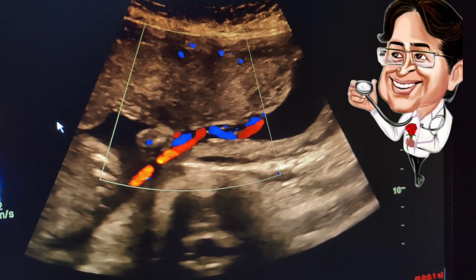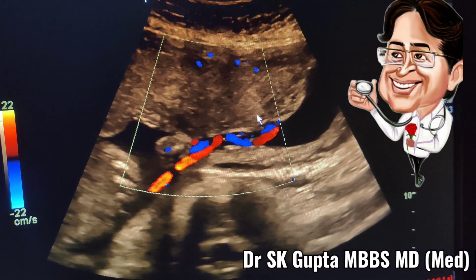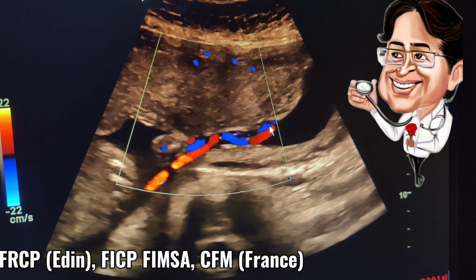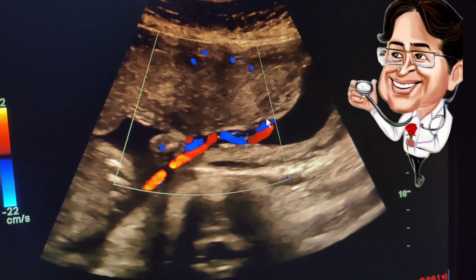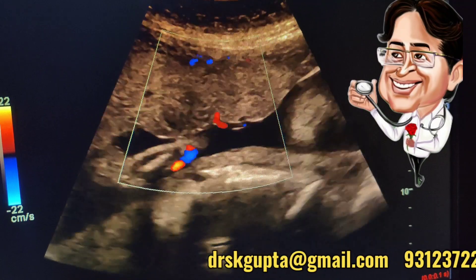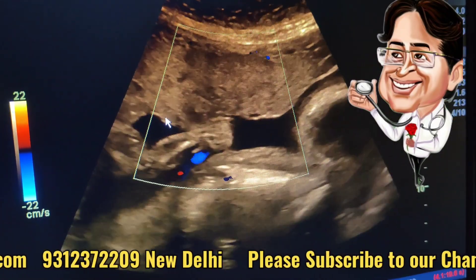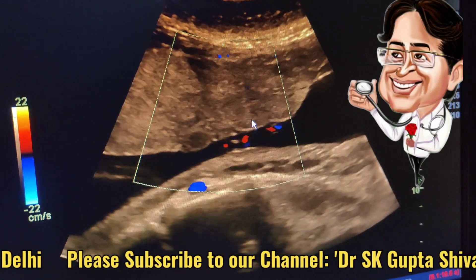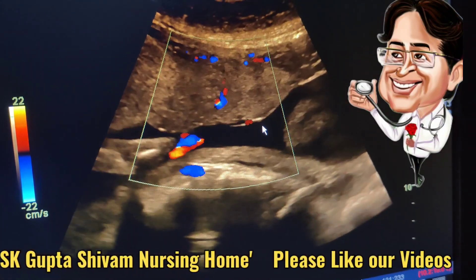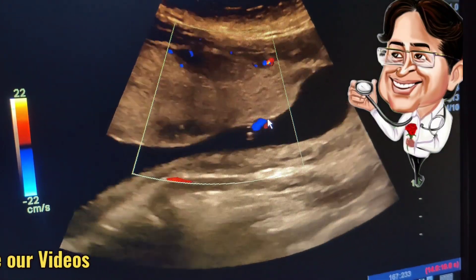You can see that she is a primary patient who has come to us for routine level two ultrasound at 20 weeks of gestation. You can see that the cord is attached to one margin of the placenta. Usually the cord is attached in the center of the placenta, but here the cord is attached to one margin or one side of the placenta, and it is called the marginal insertion of the cord into the placenta.